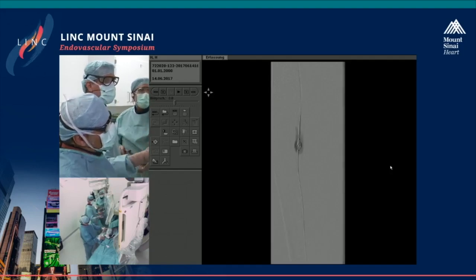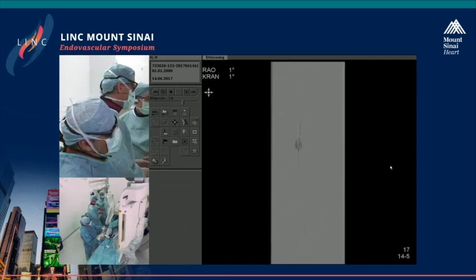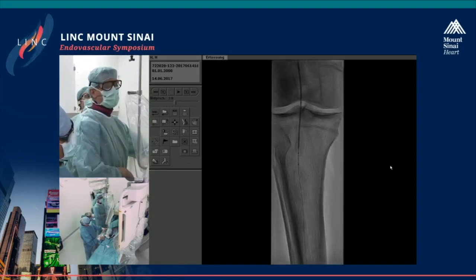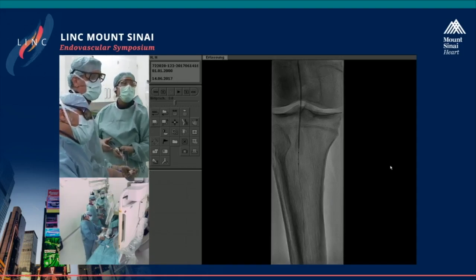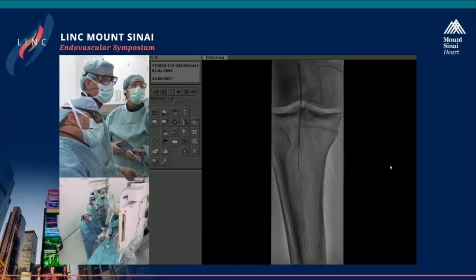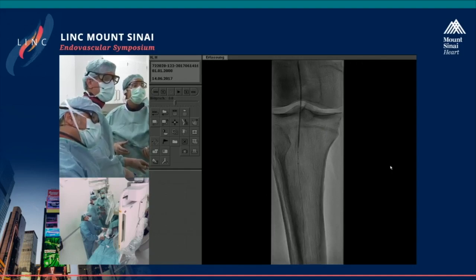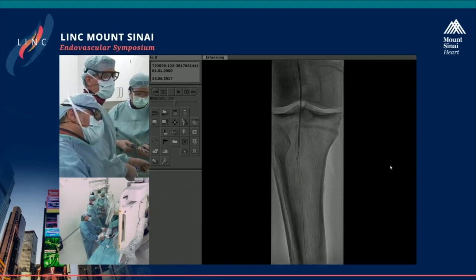And I guess you can nicely see how it spreads proximal and distal, balloon down. We may, here there is maybe a gap. This is actually, I think, the origin of the anterior tibial artery. So I try again to take the needle to the other side. And this is clearly something new compared to the monorail device, the older one. Please inflate now. So and it really works.